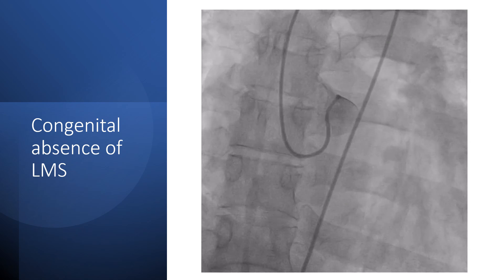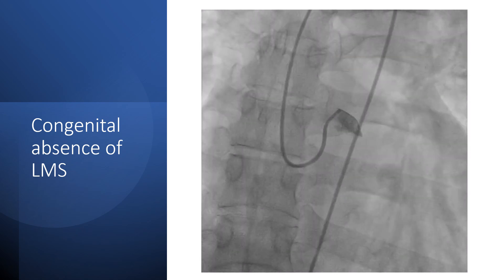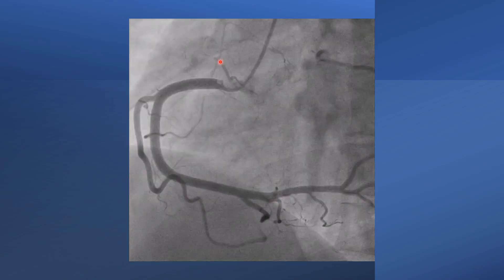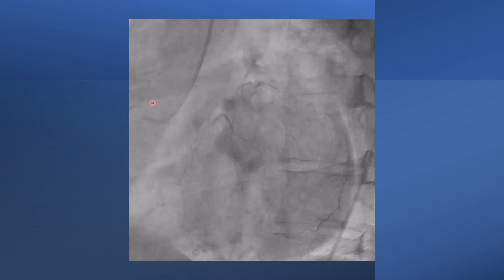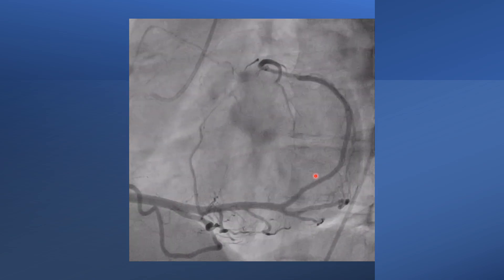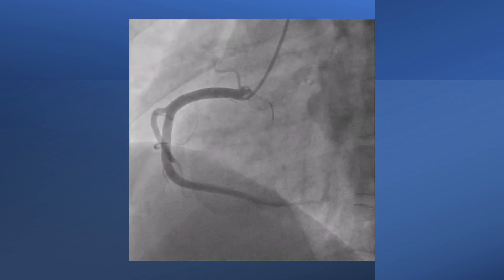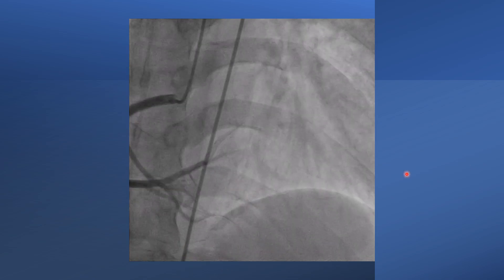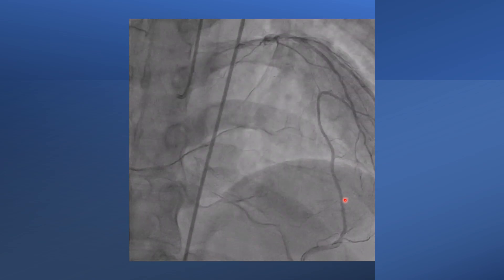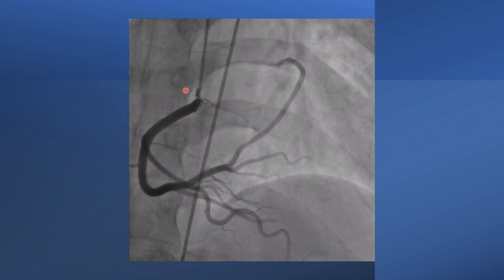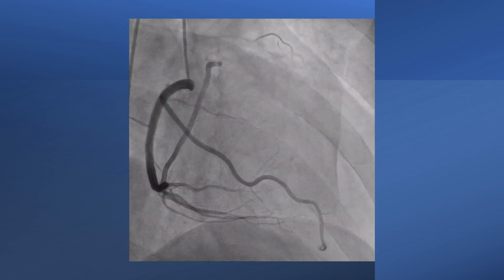This is the case of congenital absence of the left main stem. We can see a single artery that gives rise to the RCA, and the RCA continues as the circumflex and as the LAD. In the apicranial view of the same case, you can see the circumflex and the LAD all arising from a single artery.